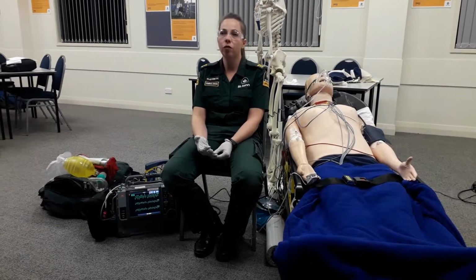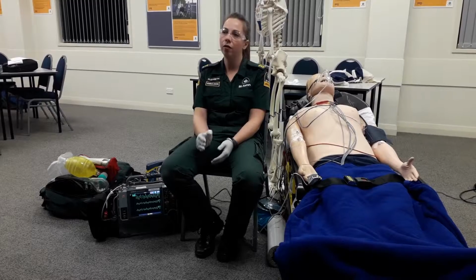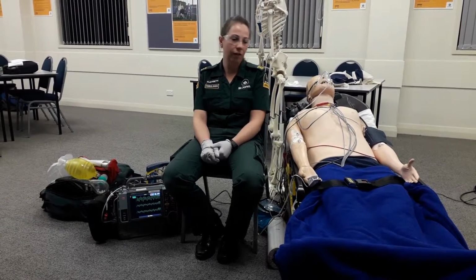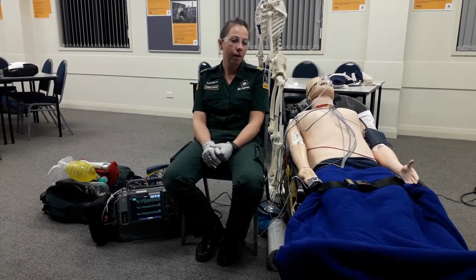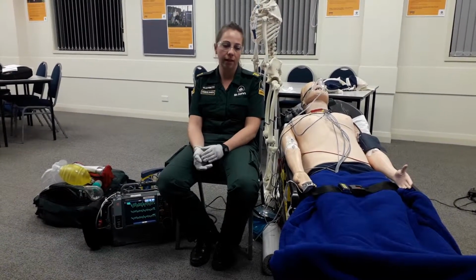Tricyclic antidepressant overdose could also cause a wide complex tachycardia like this. However, he's not prescribed these and the history doesn't really fit in with that situation. Finally, I'd like to consider electrolyte imbalances such as hyperkalemia. However, given the history and his medications, I'm not thinking that's the case today either.